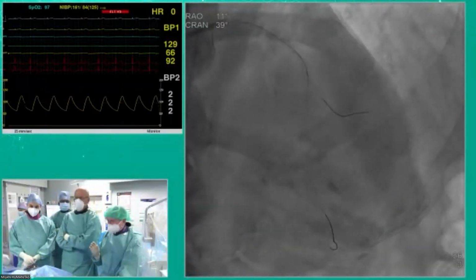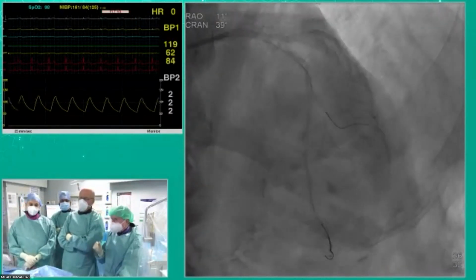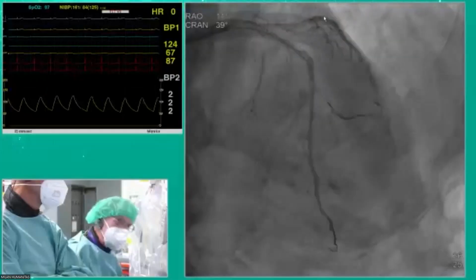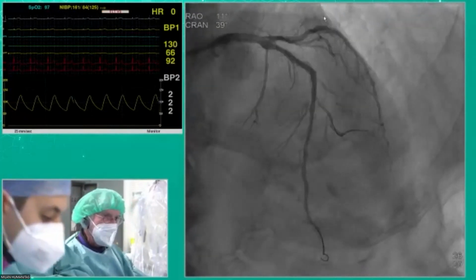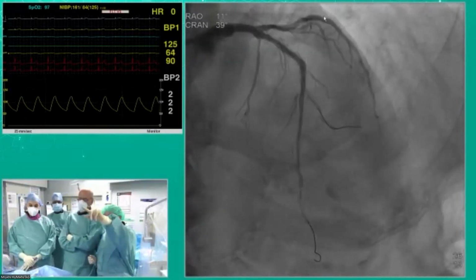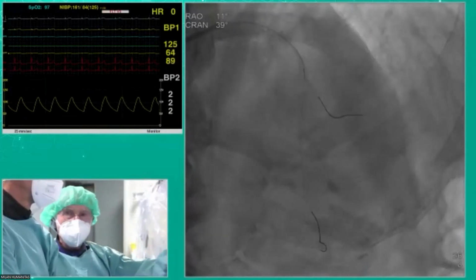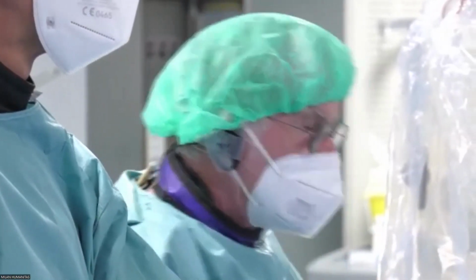I got your question. I think someone who is starting should place a stent, and slowly. Again, the marginal gain of not placing a stent proximally is minimal or almost zero. Maybe if this patient has to go to surgery in one month, that's a good reason not to place a stent proximally. But if you have any doubt, if you are entering this field, you should move slowly, and you should understand there is a big gain in not placing a stent distally, because you don't want to compromise the diagonal or the septal, and you don't want to place a 2.5 by 38 millimeter stent. Proximally, a 3.5 by 18, 20 or 16 makes no difference. So you understand the difference between A and B. Great summary.